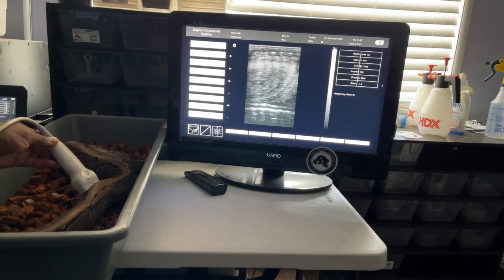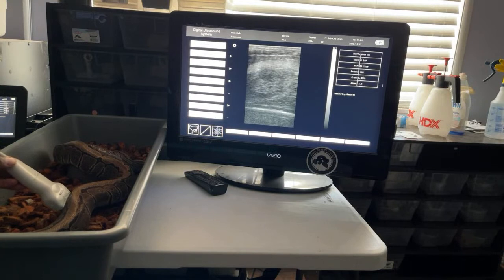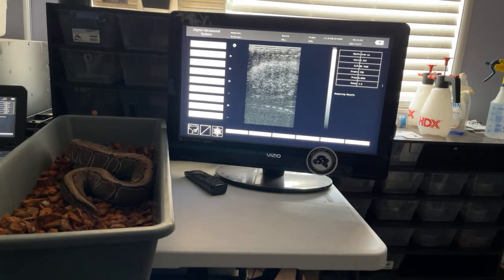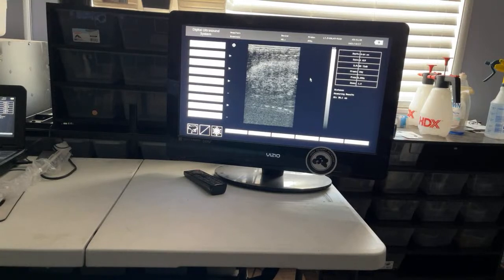So, these are eggs. See the transition in the humps and how they're pressed up against each other. So I know from this screen, freeze, that from end to end is about 40 millimeters. So I know when I measure that, that's what it's gonna say. And she's doing about 3 weeks. Let's see, measure this. Boom. Yeah, so there's still room on the other side, and that's that 38.1. So, yeah, she's going to go. And that would be my last DG clutch of the season. That was a yellow belly desert ghost to the pinstripe het desert ghost. And, yeah, that's the DG stuff. You can hit reset. See if you got anything else.